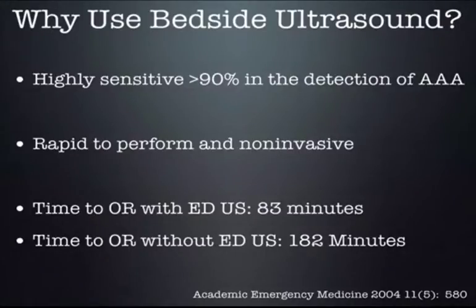So we have a high mortality, time-dependent illness that has a non-specific presentation, and we have a study that has a high sensitivity, is very easy to perform, is non-invasive, and is a rapid test that can cut your time to definitive care in half. All good reasons to bring a point-of-care ultrasound to the bedside early in any patient you're considering who may have the diagnosis of ruptured AAA.